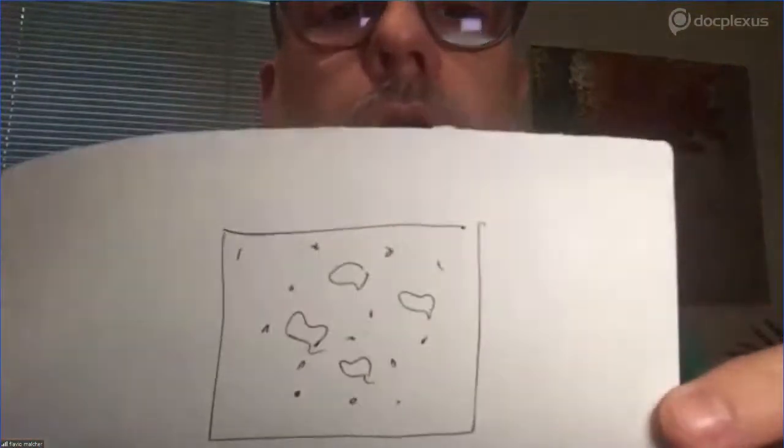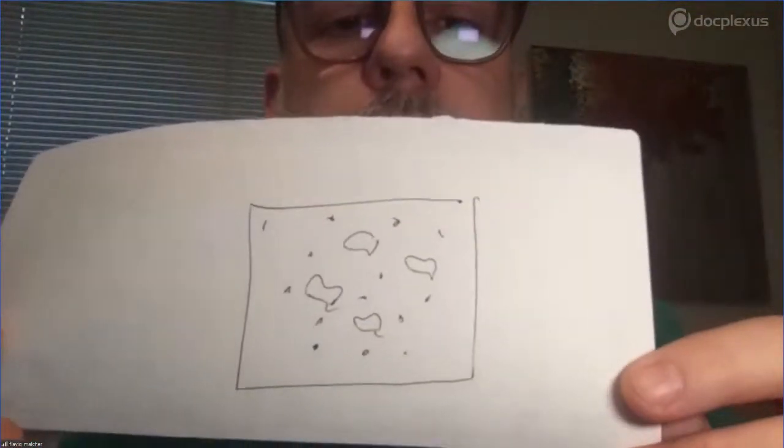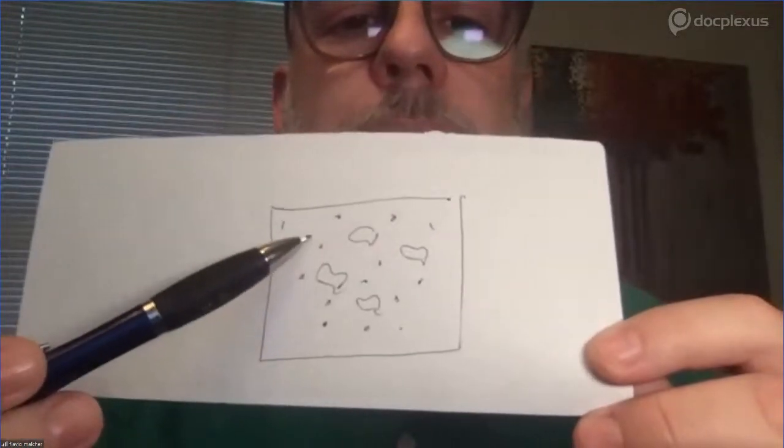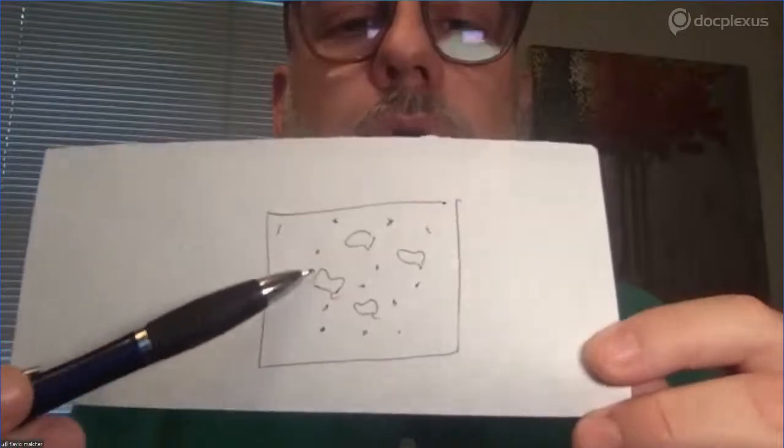But the tip for me is, I don't know if you can see this, but if you have those little holes, you can imagine that my rectangle is my mesh, and I have those holes. I just put the mesh and tack around the hole. I just want to seal the space between the mesh and the peritoneum. I don't want to leave a dead space, because when you leave a dead space, you can have an internal hernia.